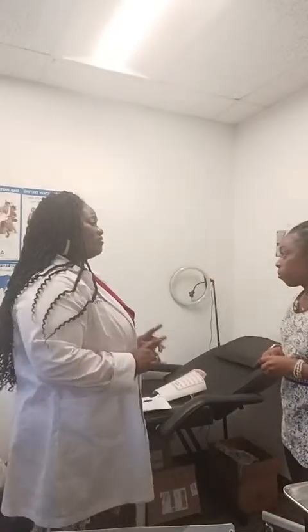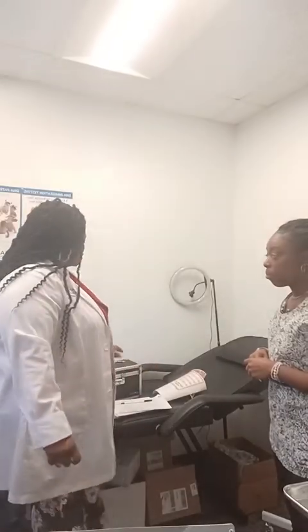Thank you so much. Now what I want you to do is give me at least 45 milliliter of urine. You're gonna go ahead and void. We consider this process void. We say void. But before you go, you cannot flush and you cannot wash your hands. If you do, I'm gonna have to void the test. You have to emphasize that and say that over and over again, because if they do go flush and wash their hands, the test is gonna have to cancel.